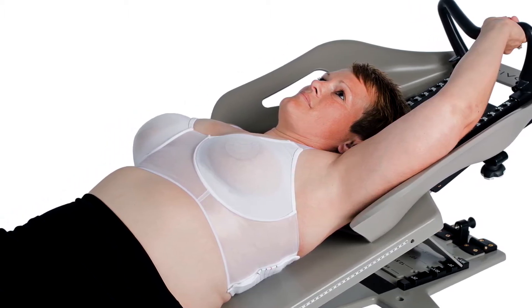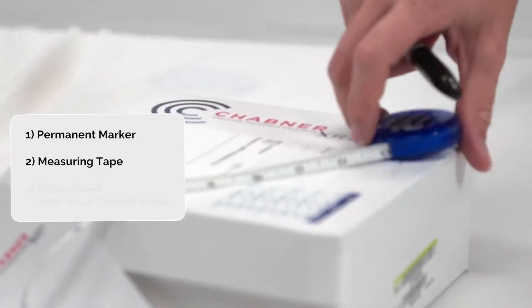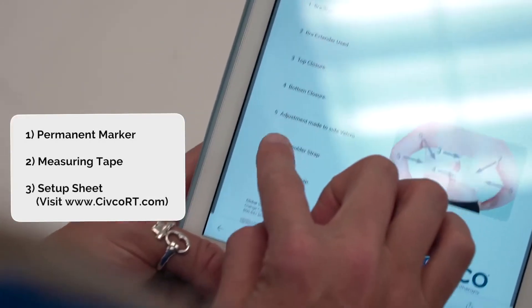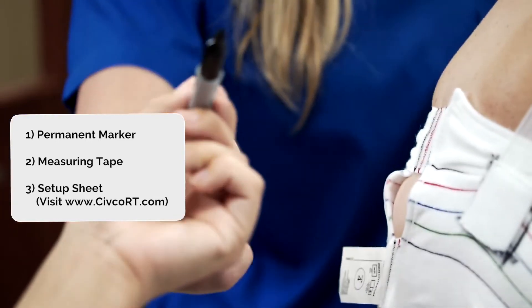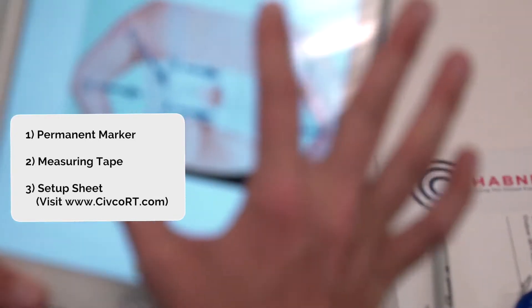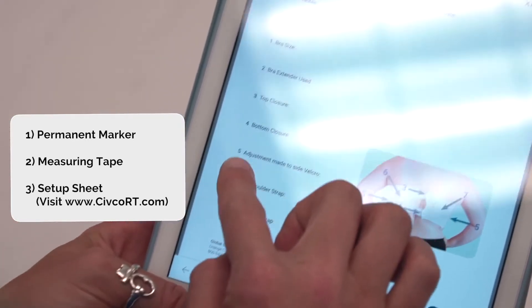Let's walk through the process for fitting the bra for optimal treatment. Before sizing your patient, make sure to have a permanent marker, measuring tape, and Chabner XRT setup sheet. These will be needed to measure your patient's bra size and make indexing marks on the bra. The setup sheet is available at www.civcort.com.